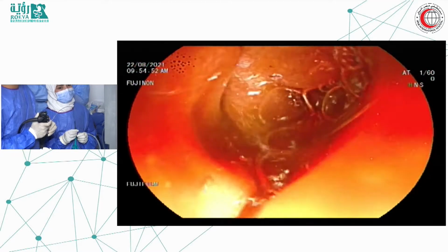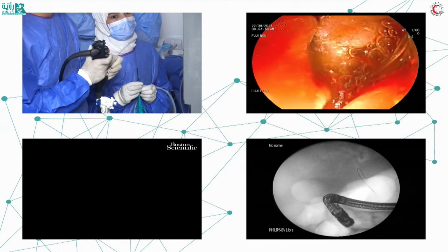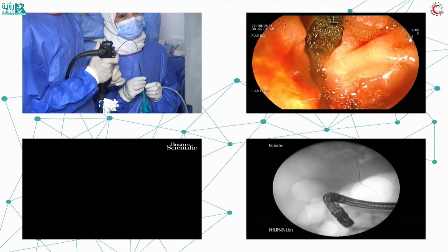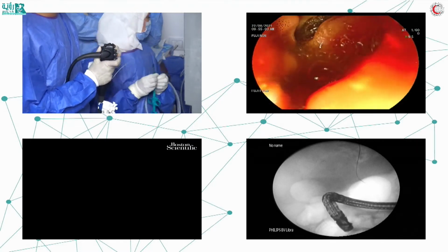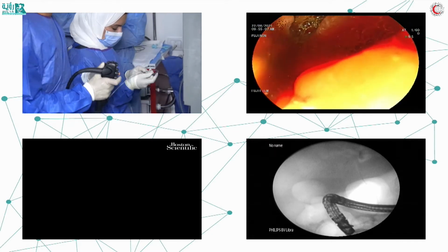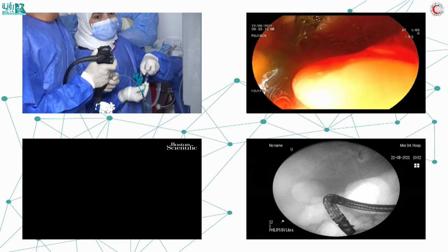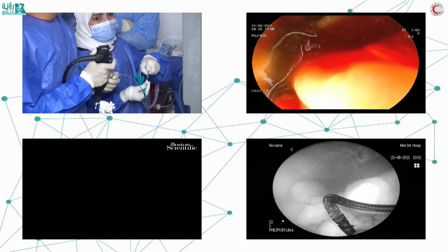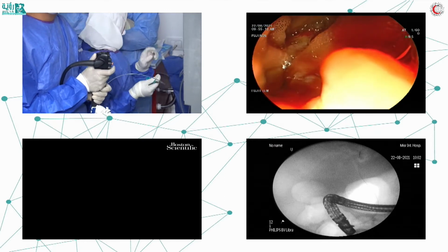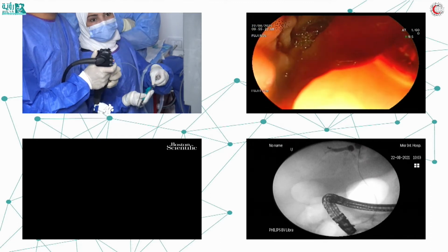Yeah, I agree. The problem is that I think all of us agree that in many cases we still cannot reach an absolute diagnosis using the pathology. We still know that the SpyBite has an accuracy of about 70%, so you will miss 30% of malignant cases. So sometimes we depend on your clinical impression, whether this is a malignant tumor or a benign one. Okay, sorry, continue.